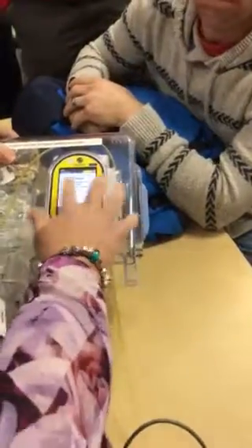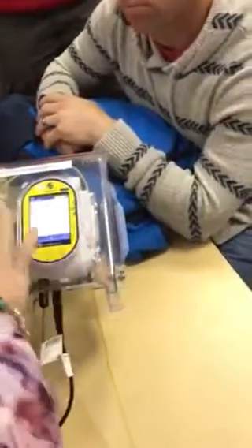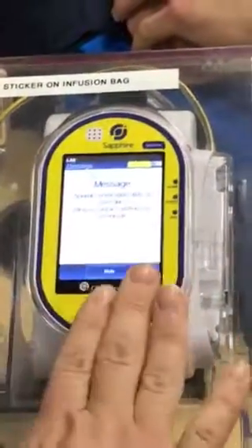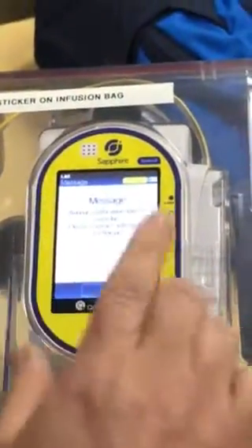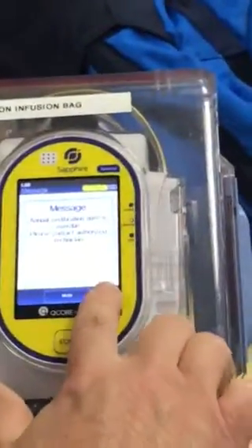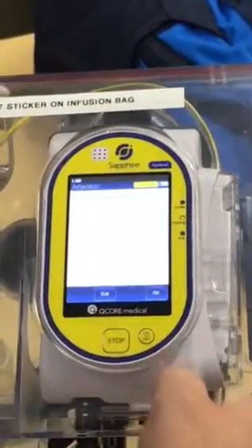It's telling you that the annual certification is overdue. These pumps are managed by a third-party system that we pay for, so you can just ignore this. It's just telling you that they should be maintained. We supply DEA numbers and everything for it. So we'll just hit OK. It still works.